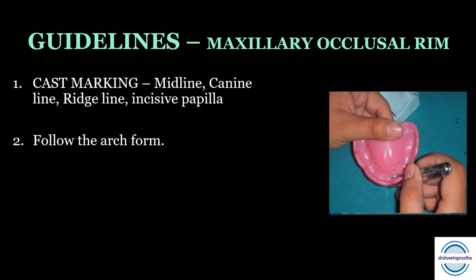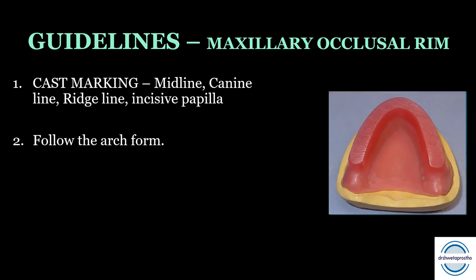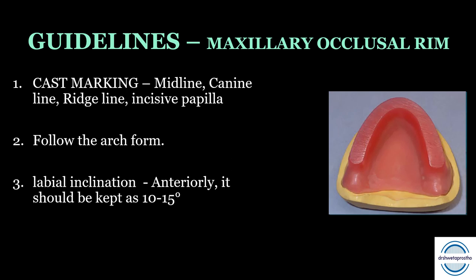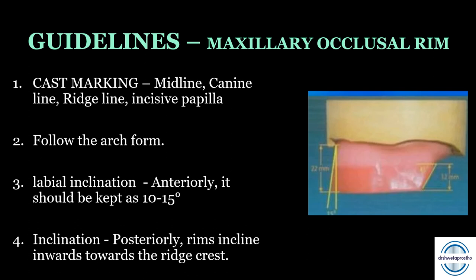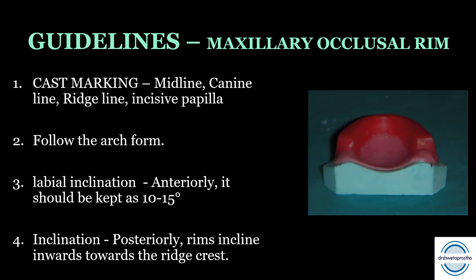After cast marking, the occlusal rims should follow the arch form — whether square, tapering, or ovoid. Anteriorly, the labial inclination should be arbitrarily kept at 10 to 15 degrees in the central incisor region, as seen in the picture, which can later be confirmed clinically depending on lip support. In the posterior region, the rims should incline inwards towards the ridge crest.